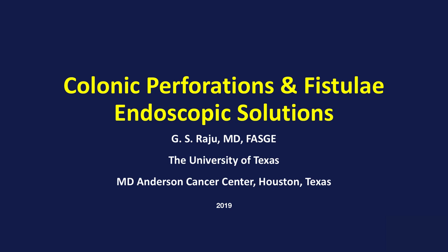Greetings. Let us talk about endoscopic solutions for colonic perforations and fistulae.